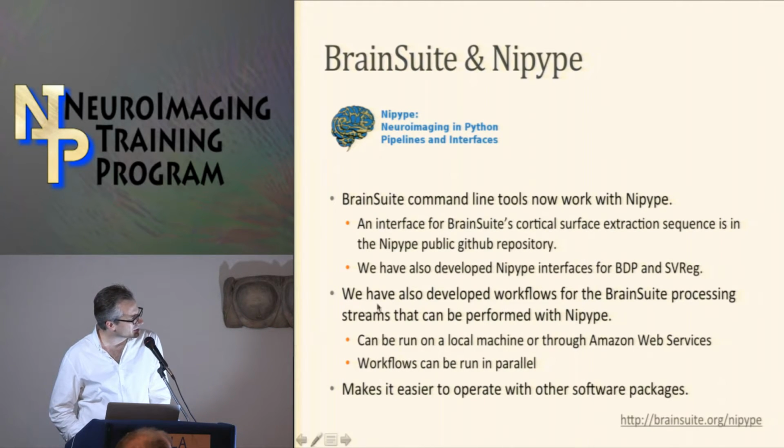And he's even gotten this to work on the Amazon Web Services, so if you wanted to run it on your local machine or on the cloud, it's possible. We don't have the instructions up on the site yet, but probably when he comes back from the summer break, because he's an undergrad. And he got a good internship, so. We'll be adding that to the main distribution so that you can run it on the cloud.